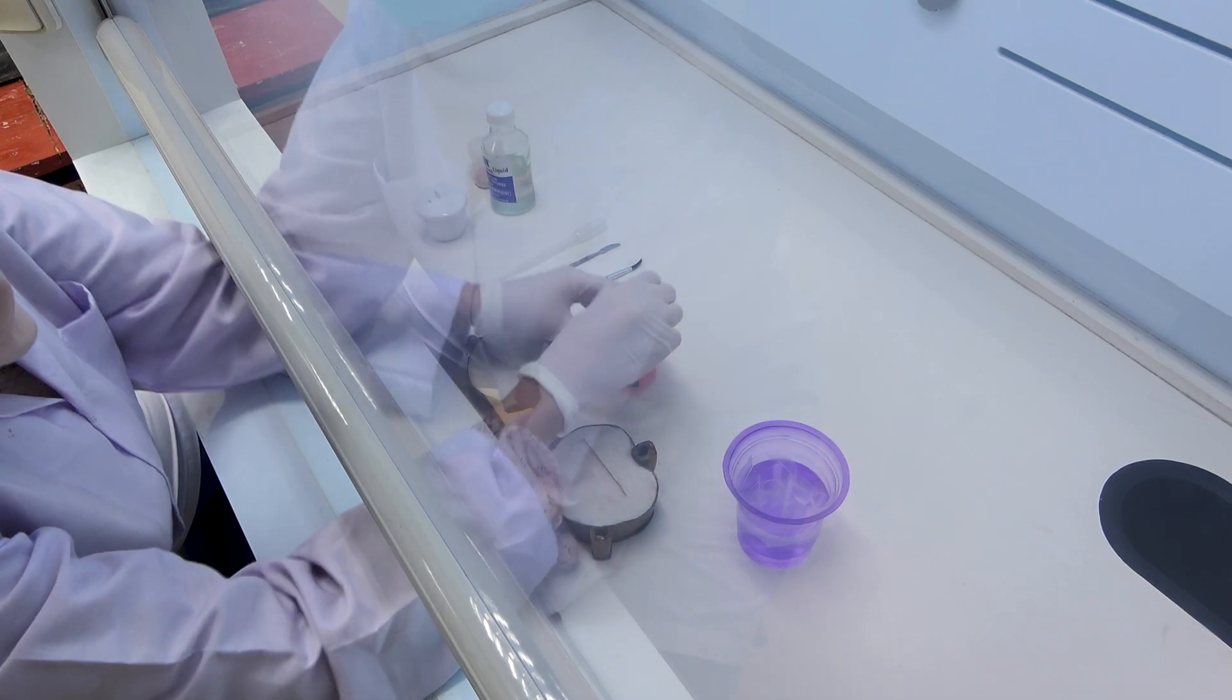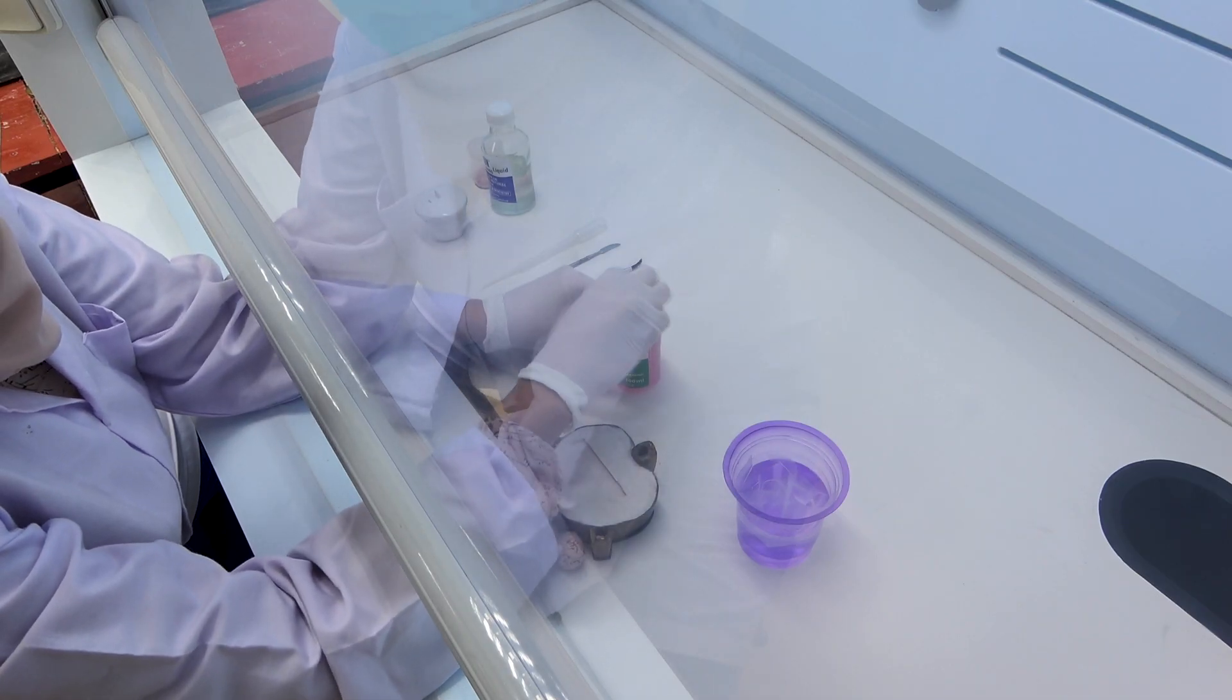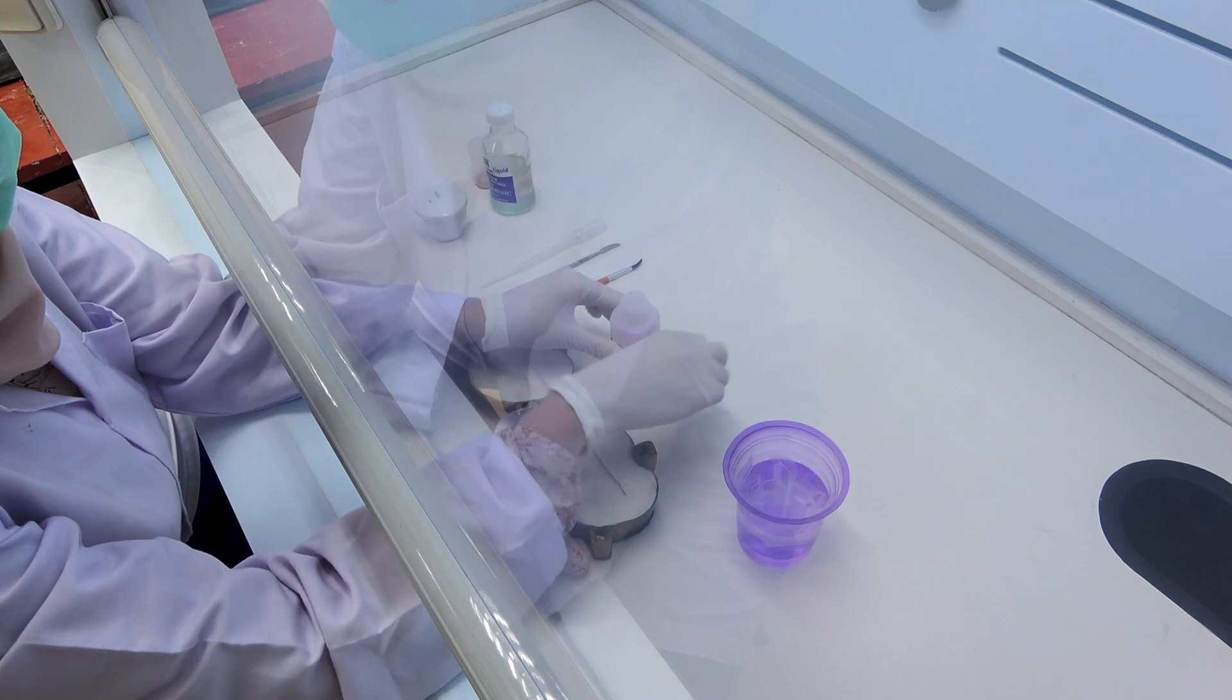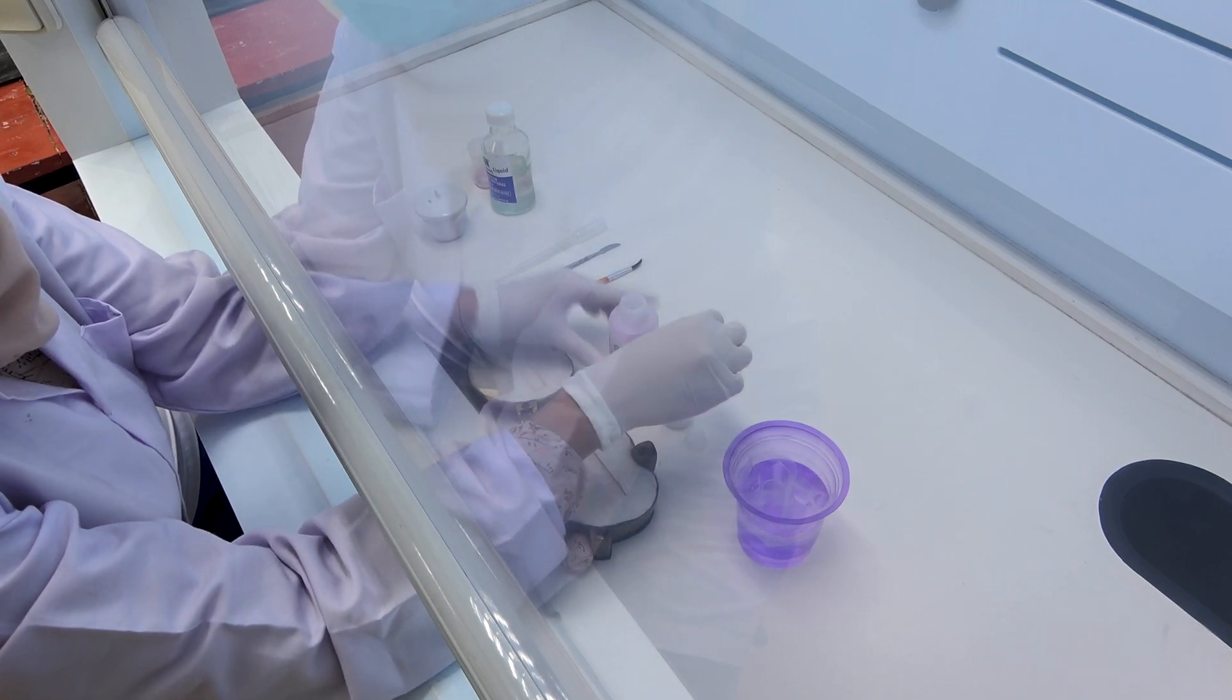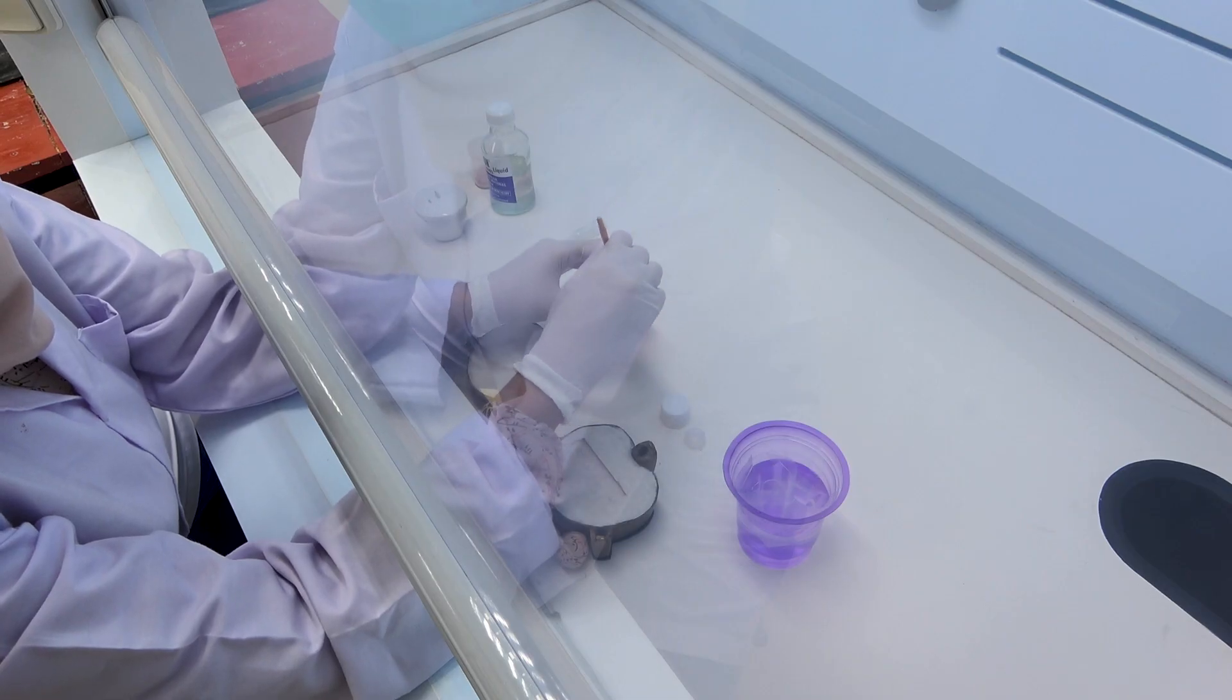First, apply CMS evenly to the gypsum mold on the upper and lower flask using a small brush with unidirectional strokes, and let it dry.